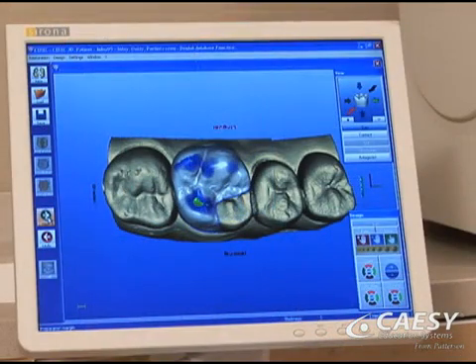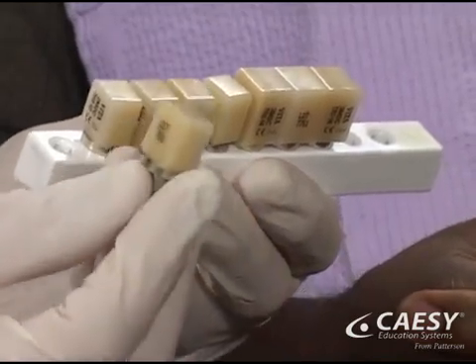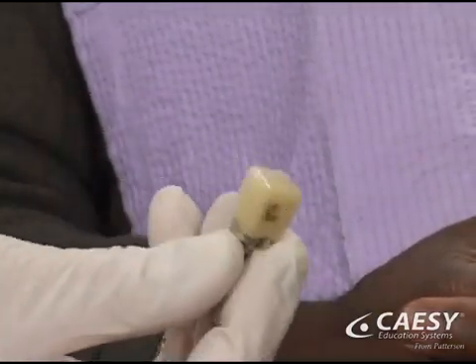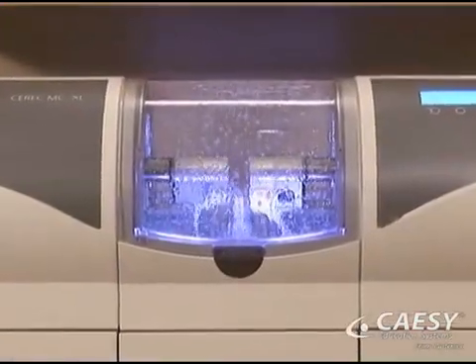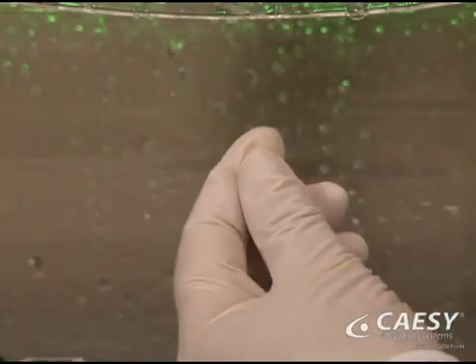After we carefully design the restoration, we select an appropriate material of the proper shade for your specific tooth. We place this material into the milling machine, which shapes it into a custom-fitted restoration.